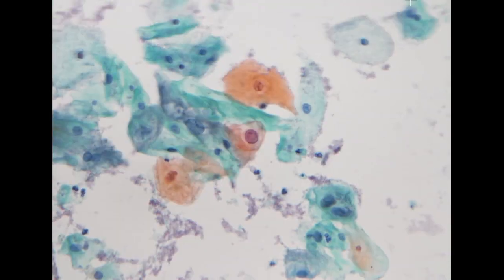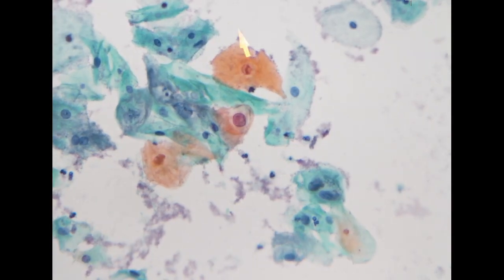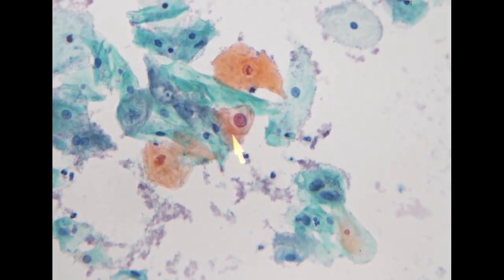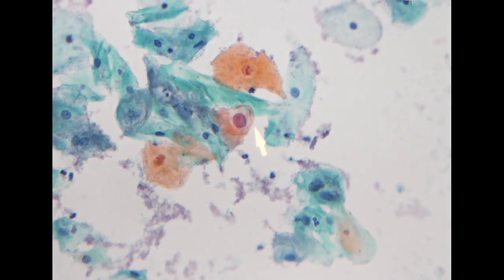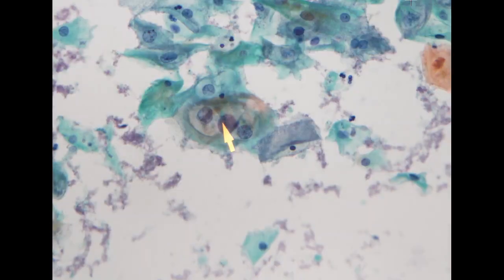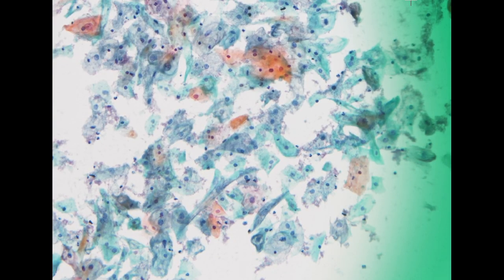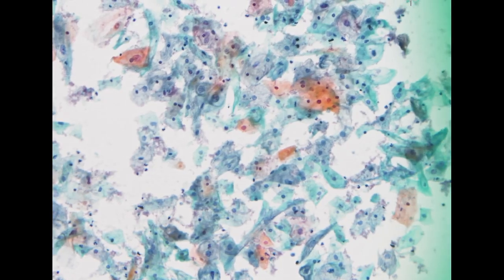So then we start to see more of these type of cells. Again, superficial cells with enlarged nucleus, and you start to see these perinuclear halo patterns with a sharp margin. So this is a koilocytic change. So here we also see koilocytic change involving the intermediate cells. So I think for this case, it is okay that we just call this a LSIL. In the other slide, we also see a couple of koilocytes. So this is a LSIL case.